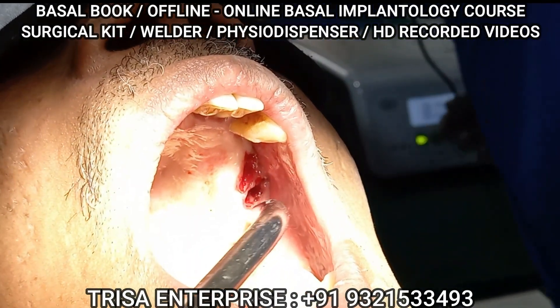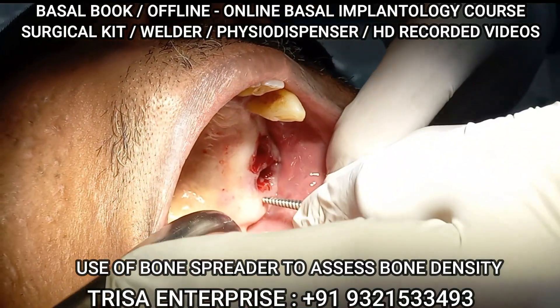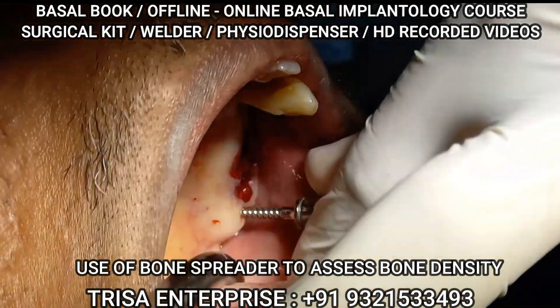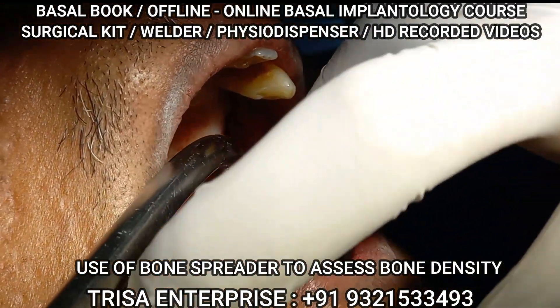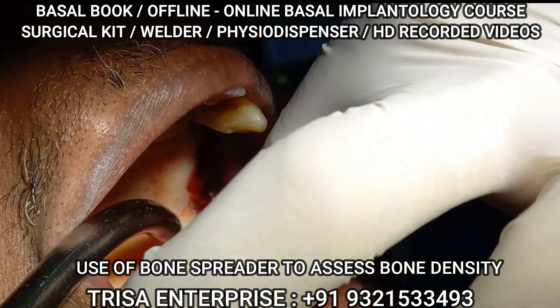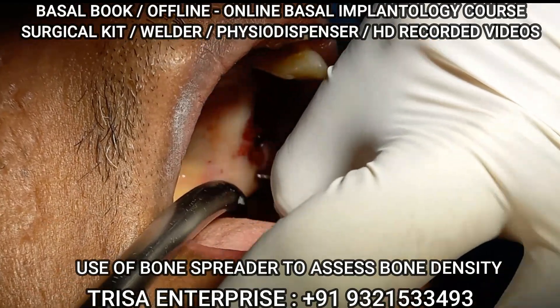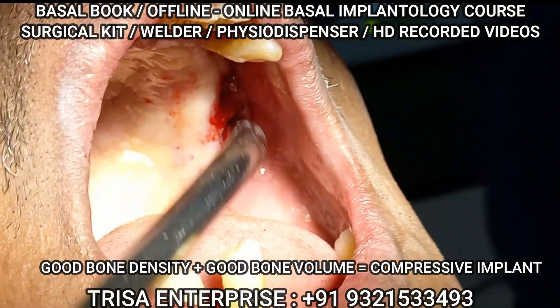I'm increasing the speed — yeah, that's it, done. Now here's a good concept: if I'm not sure what to do, I can pick up my bone spreader and check the bone density in this area like this. I'm using my fingers while talking, and I know I'm taking effort to drive this in — that means the bone quality is good. Height is also there, so definitely I can use a compressive implant. In this case I will use a 4.5 compressive implant.